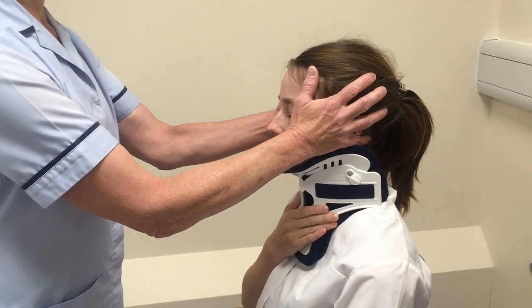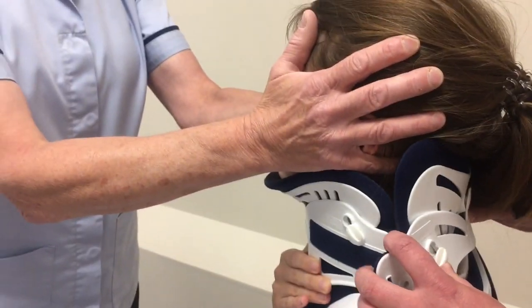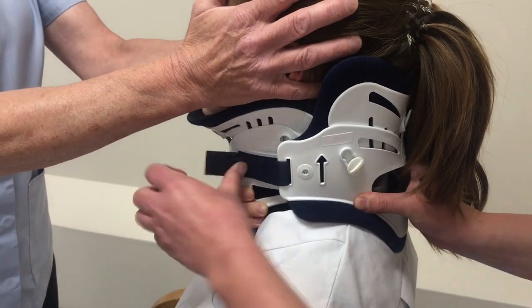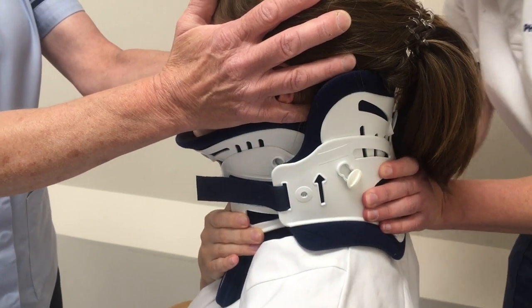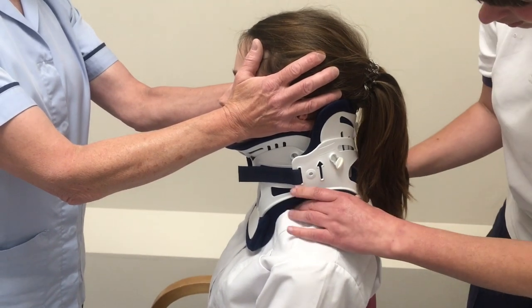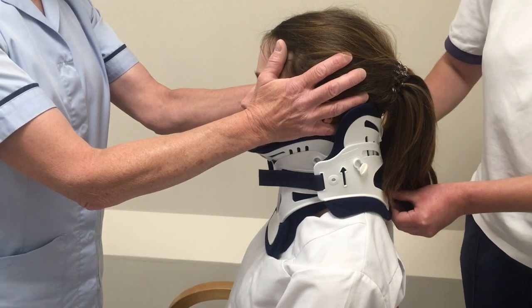We'll change the pads, give a nice fresh pad, and then come back on. Checking the hair that it's not too tucked in, going underneath it, and topping it over. Making sure clothing is not caught in the collar.